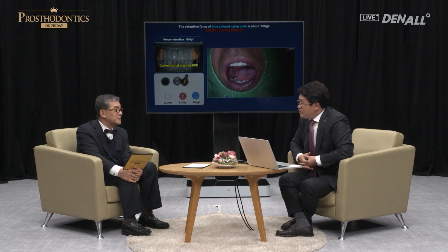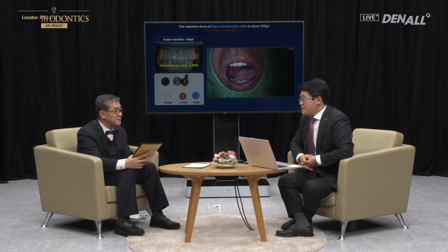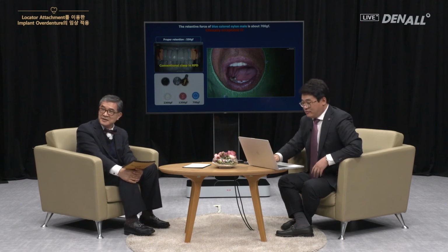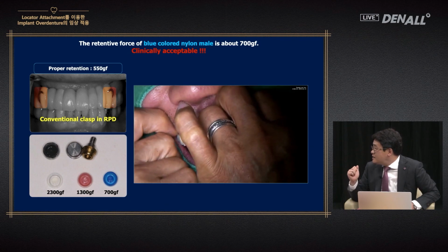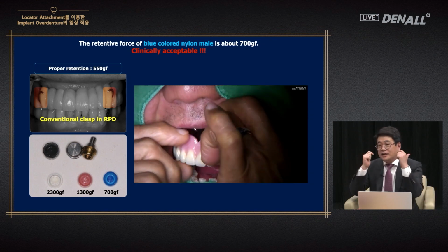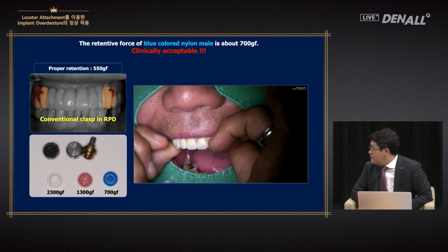Clinically, the white is piling up, and I'm lacking in blue. I hope the vendor provides more blue. You cannot order just blue, you have to order in sets, so the white is piling up. It's quite strong, as you can see. This is a male patient, and the patient is struggling to get it out, even though it is blue. It is quite difficult. Therefore, I make a ring or notch so that the patient can use it with more ease.